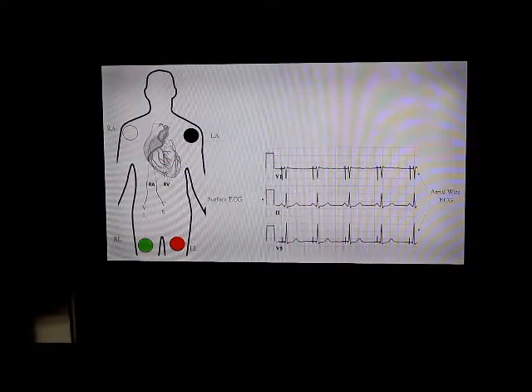So this will give you a surface ECG. Okay? And then you connect the wires to 2 other leads that are kind of far apart from them to get a bipolar signal. So we usually choose V1 and V5. And then you set up your printer to print those 3 leads. So when you print it out, you will have in the middle a surface ECG.